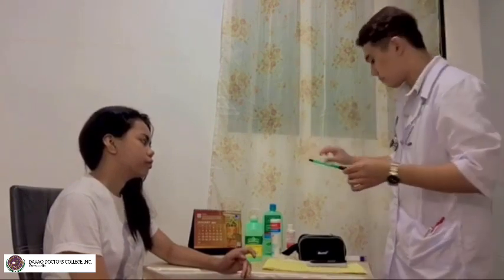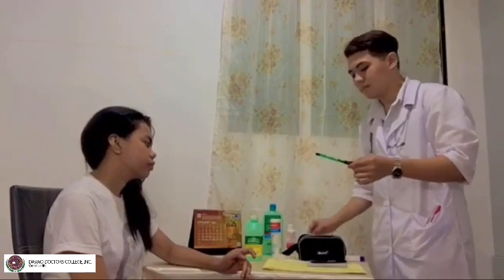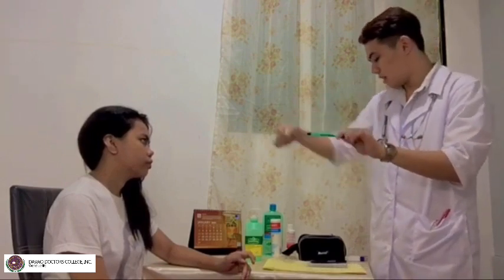So, now, remove the thermometer and wipe the tip or the probe of the thermometer sensor with an alcohol swab from stem to probe thermometer. So, just give me a minute. Okay, so now we're going to use another wet cotton from stem to the tip, and then another dry cotton from stem to the tip. Okay, so now we need to remove any gloves if necessary and perform hand hygiene.